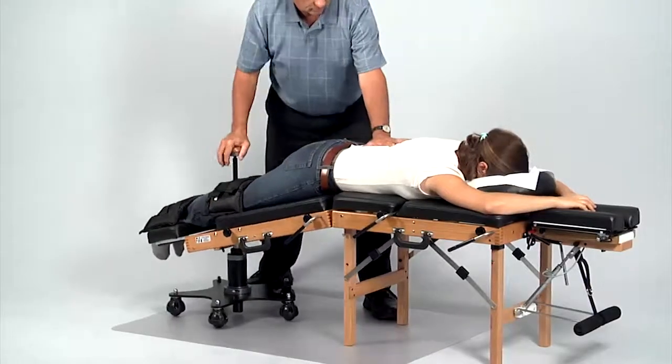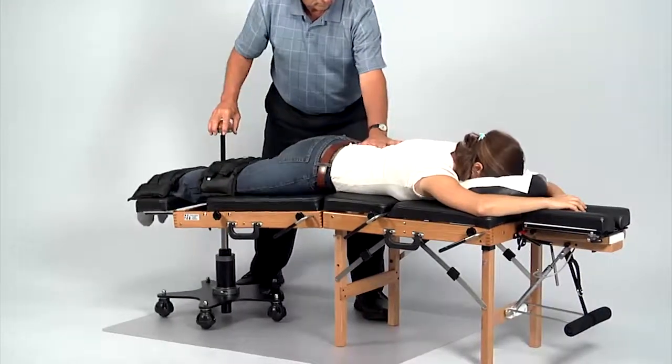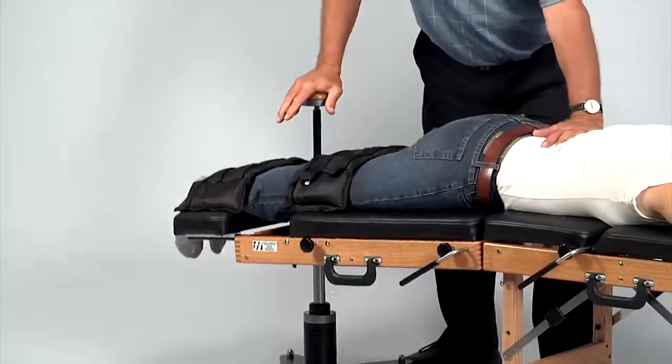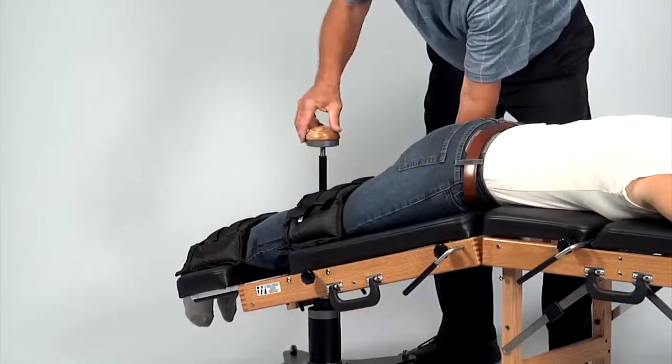The mast's position indicator button is in the red position, allowing Dr. Thule to flex the table. He achieves distraction with one hand on the patient's back pushing gently away while flexing the back half of the table with his other hand. He may lock the table at any angle by turning the control knob to shift the button to the white position.